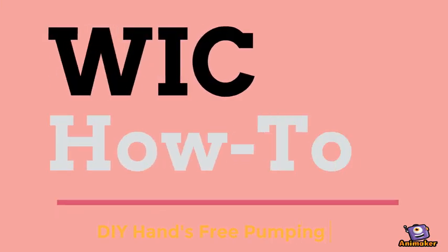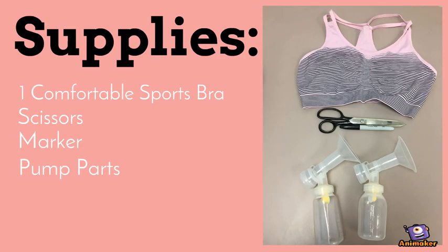Welcome to a WIC How-To, a DIY hands-free pumping bra. For this DIY, you will need a comfortable sports bra, scissors, a marker, and all of your pump parts.